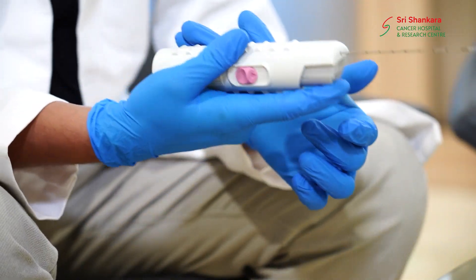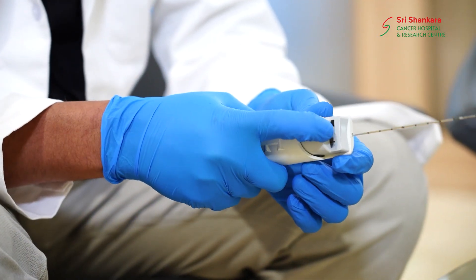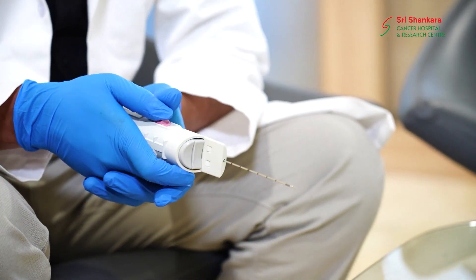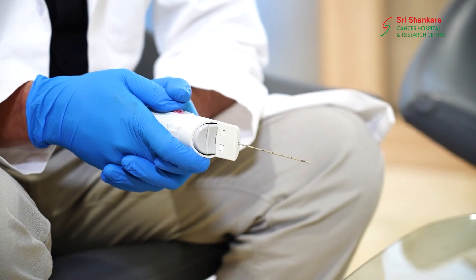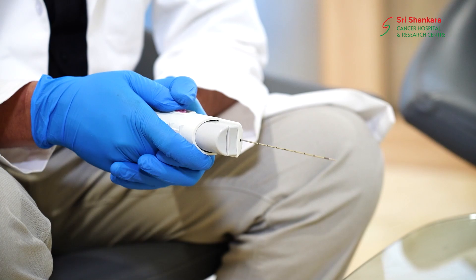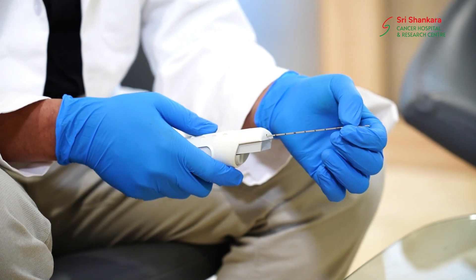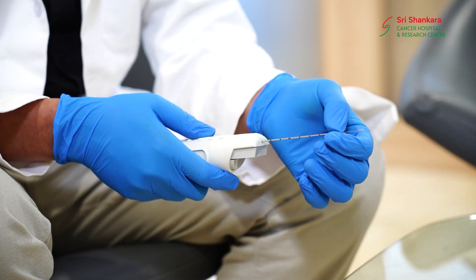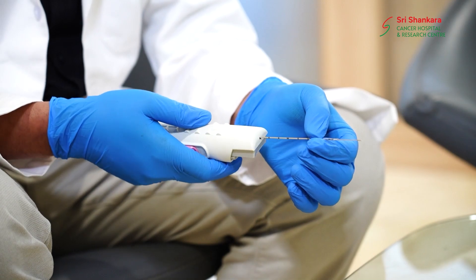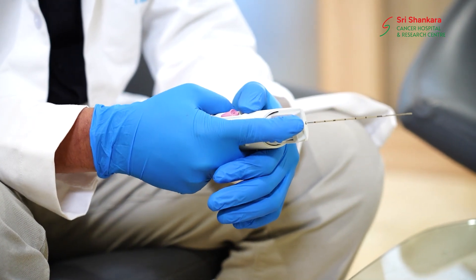There is another gun — we call it the automatic gun, fully automatic. You load it and it just gets triggered. Again, the tissue in this depression or wedge gets collected, which we send to the lab for analysis.